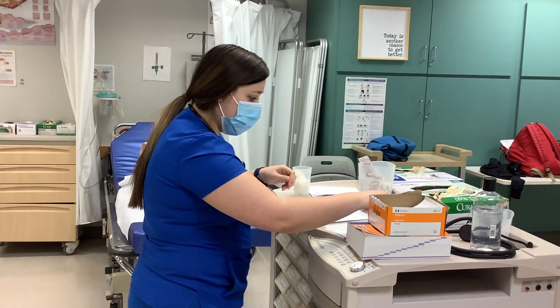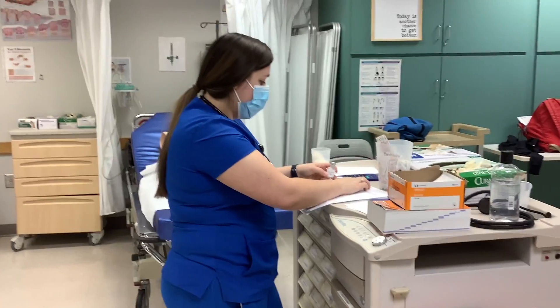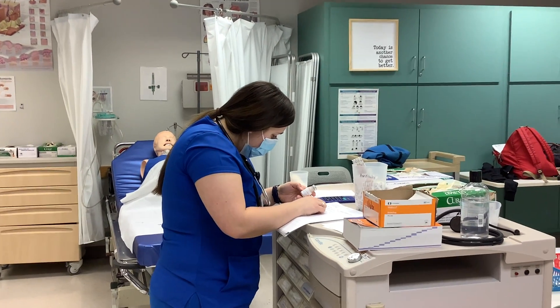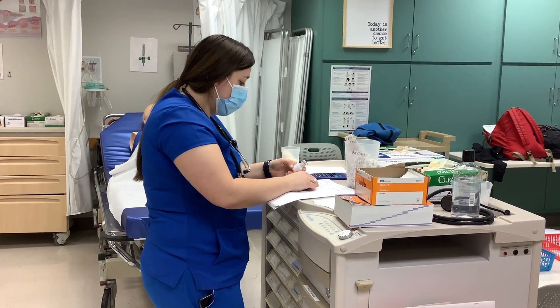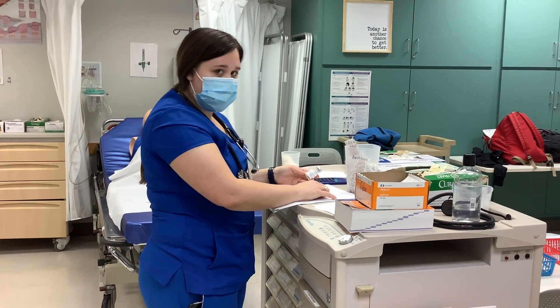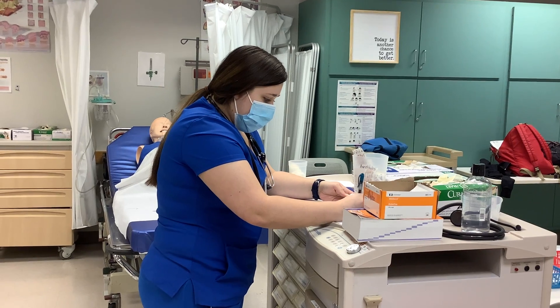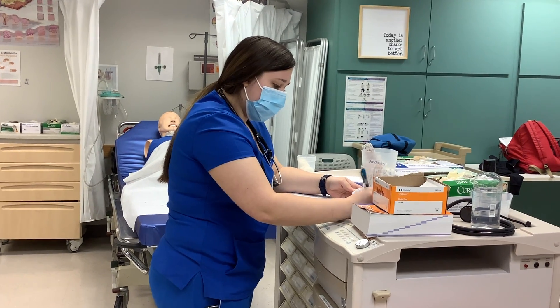And then we're going to do our second med check, starting back again with the Fluzone. Patient name Emily Johnson, patient ID 361-80-6612, date of birth 12-16-XXXX. Allergies are morphine and codeine. We have Fluzone, 0.5 mL per dose intramuscularly. It expires 12-30-2050, so it's unexpired. This vial is intact and dry. It is 0730 and it has not been given. Second med-math check: x mL equals 0.5 mL per dose, which is equal to 0.5 mL per dose. So we are going to give 0.5 mL.